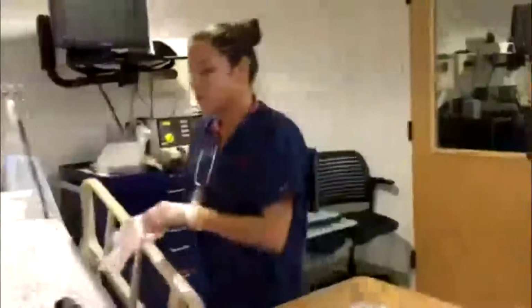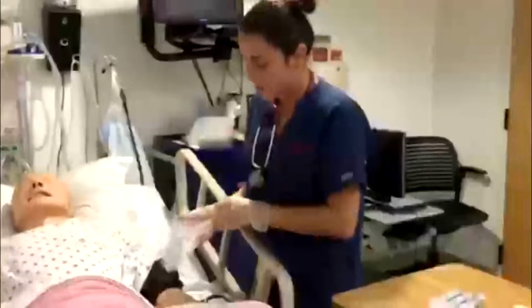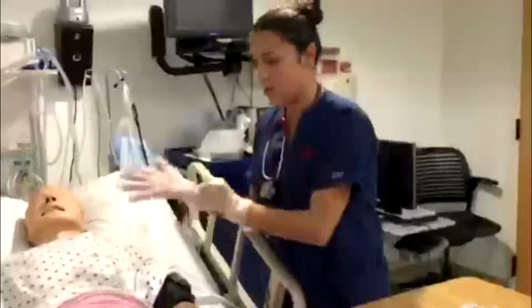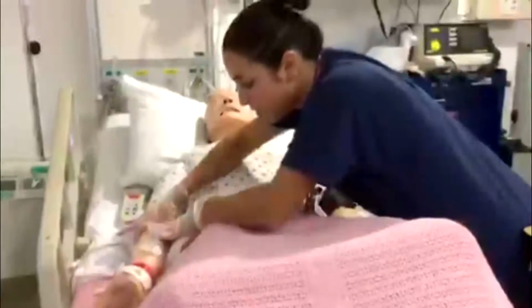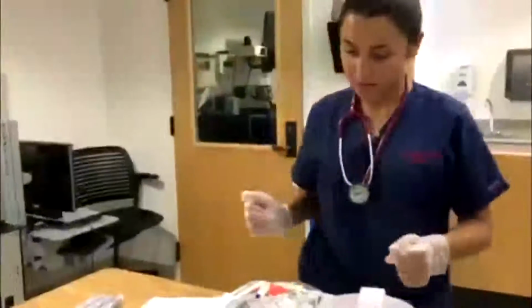So right now I'm just going to check the IV site for any redness or swelling, inflammation, extravasation, or infiltration. I know they're big words, but just making sure that everything's okay. I'm just going to look at it. Doesn't look red. I'm also checking the temperature of the site. Well, it looks really good. So we want to keep it that way, okay? And so I'll also document that you're allergic to shellfish and sulfa.